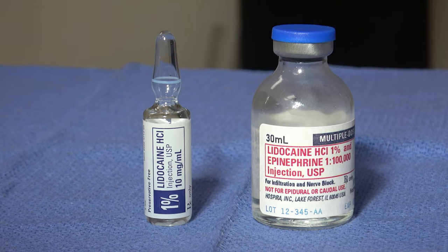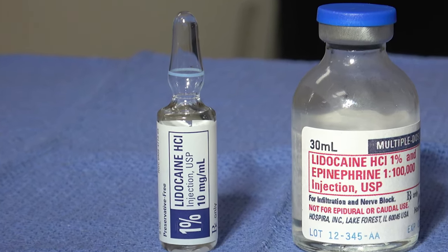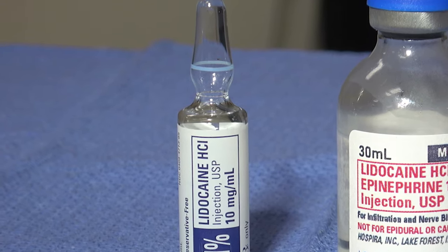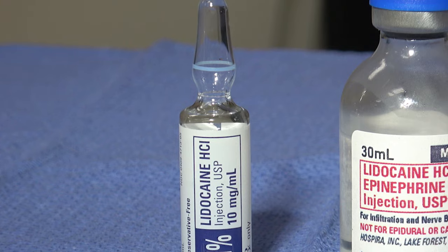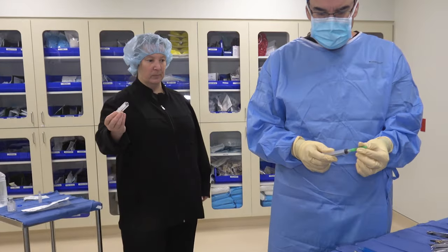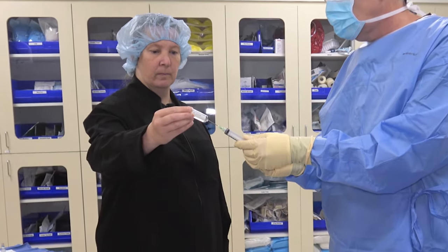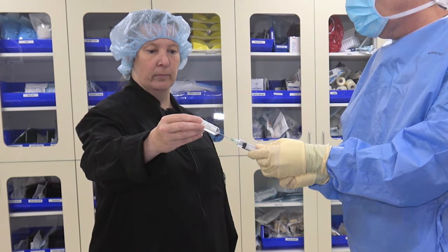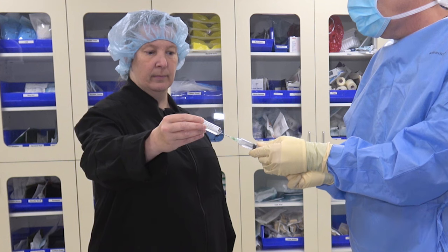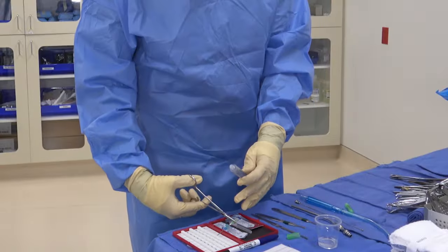Sometimes the medication may come in an ampoule. With an ampoule, the medication is completely encased in glass — there is no lid. The circulator will snap the tip of the ampoule, and when this happens there's a chance that small pieces of glass could end up in the medicine. To protect our patient, we use a filter needle to filter out any glass. We hold the needle still and the circulator will place the ampoule over the needle. Drawing from an ampoule is slightly different in that we don't inject air first — we simply start drawing up the medication.